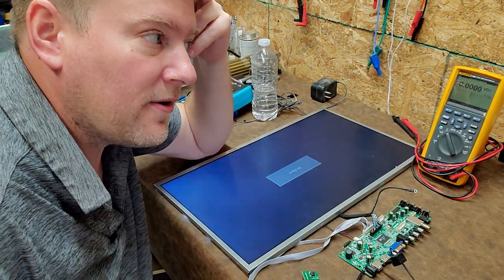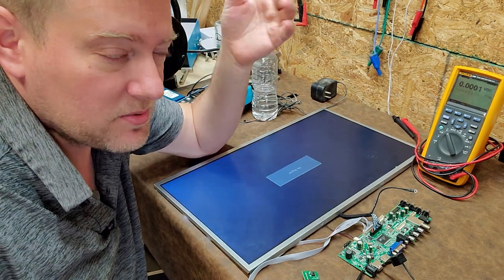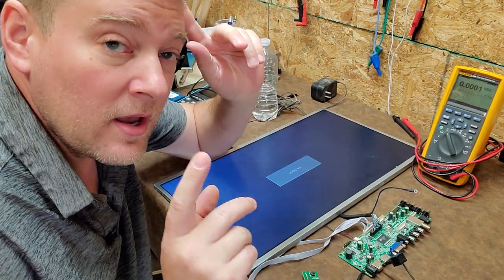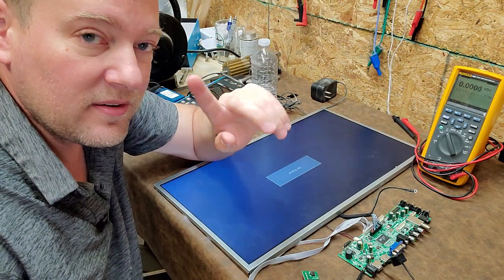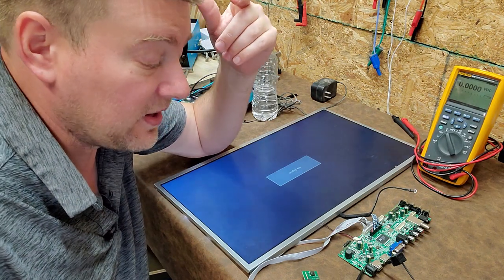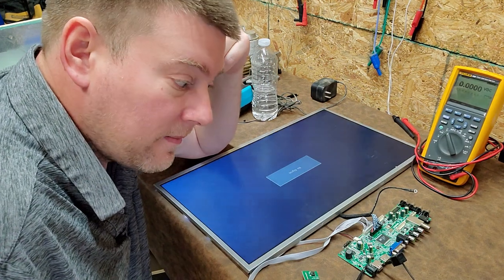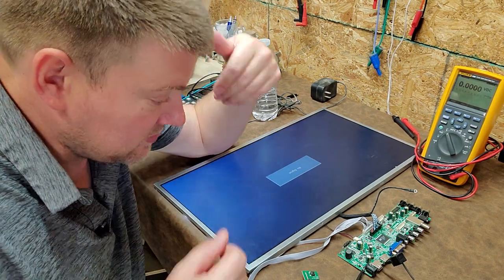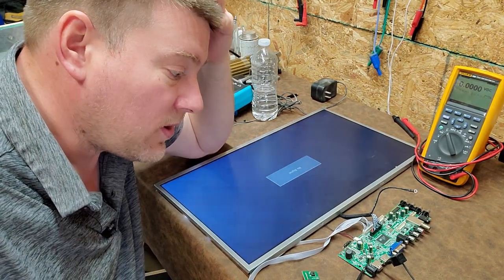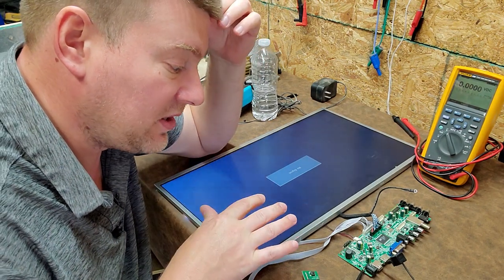The weak link on almost every single medical device is going to be your DC power supply. And that's because it's designed to be the weak link. Remember, guys, just because you have voltage does not mean necessarily that you have current. So once you go to boot up a TV or something like this, it starts pulling that voltage, and if your DC power supply can't keep up, it drops below the threshold and it will not allow it to power on.